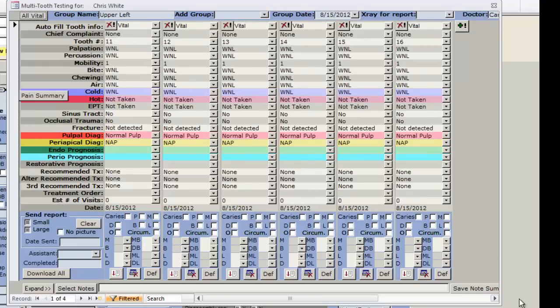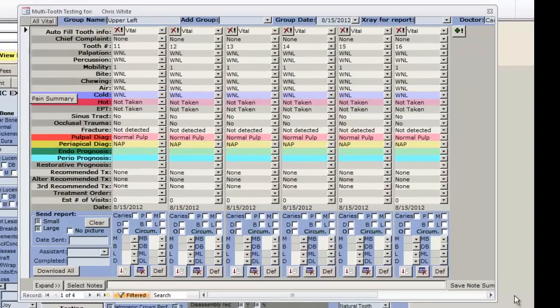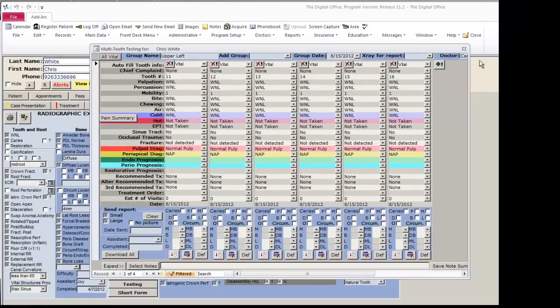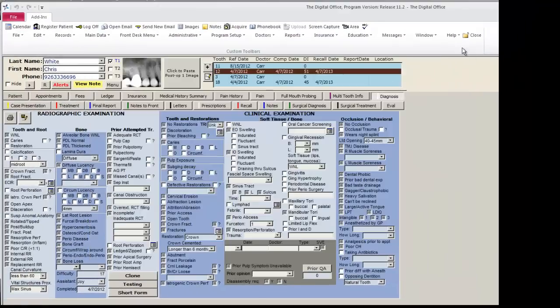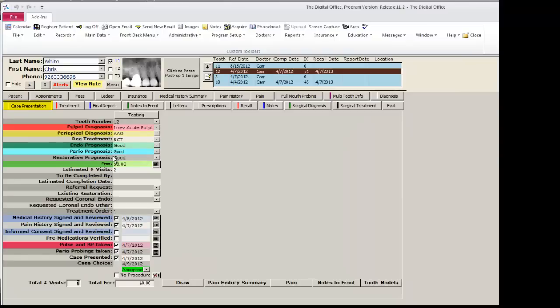Once the testing has been completed and you have come up with a diagnosis, it is time to go to the case presentation page.